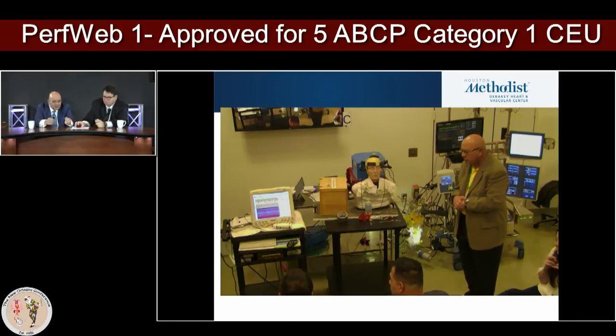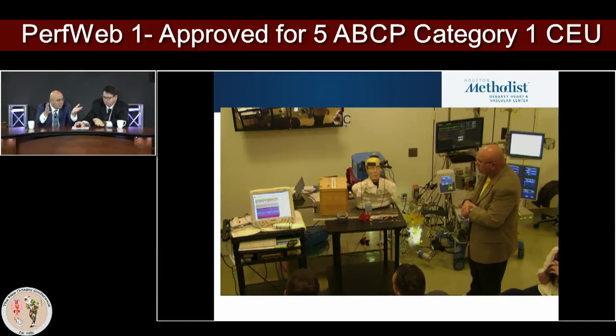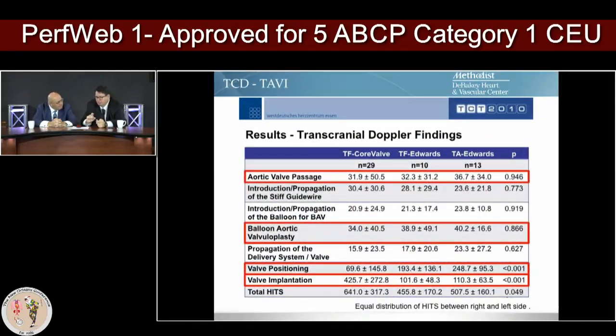It's in the circuit itself, and of course, this was crystalloid that we were using, circulating through this head. But at all of those connector points, that air will hang up, and it'll just continue, as we keep hearing this shower little by little by little until it is gone. You can't see it, but it's there, and this proves it. Yes. And I think the happy moment was when we injected the 40 micron filter, it filtered out. So we have that clip too that definitely filters everything out.